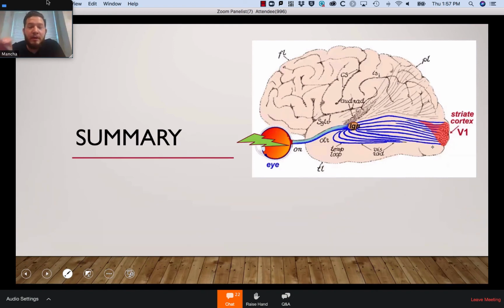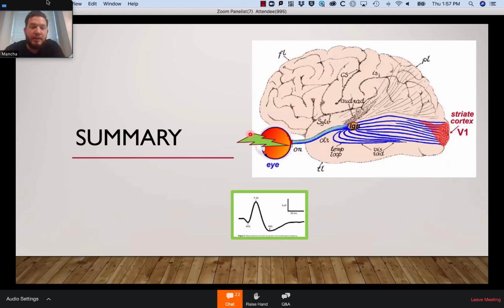So this first slide is supposed to let you know, okay, this is going to represent the electroretinogram, right? As we mentioned earlier, the electroretinogram is telling you exactly where the magic's happening. It's in the retina. So you can use these to help you discern what's going on with any kind of macular lesions or any kind of changes within the fundus. The VEP, on the other hand, is going to give the pathway from that retina all the way back to the occipital lobe. And again, that's just the VEP, and these are the typical printouts as we see on the bottom.